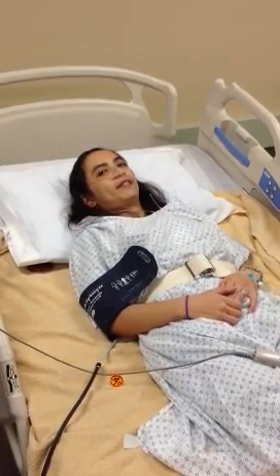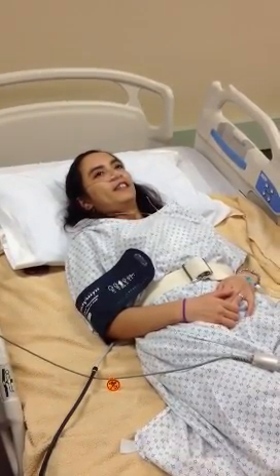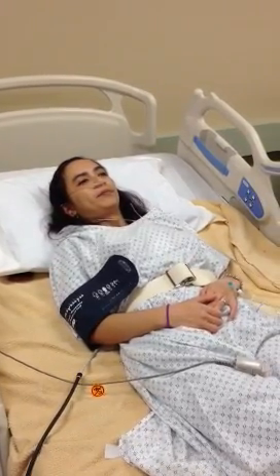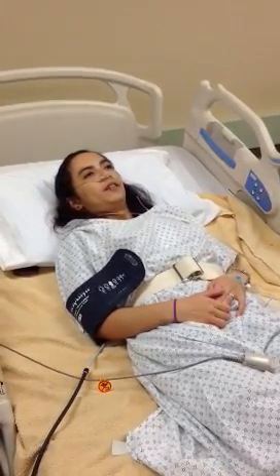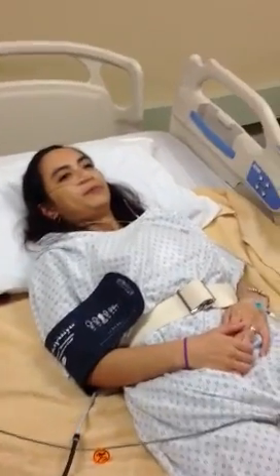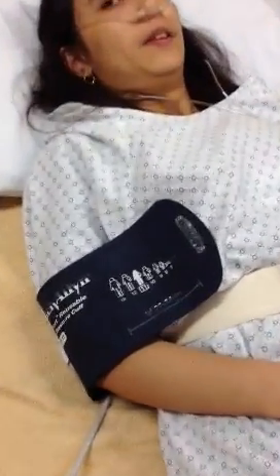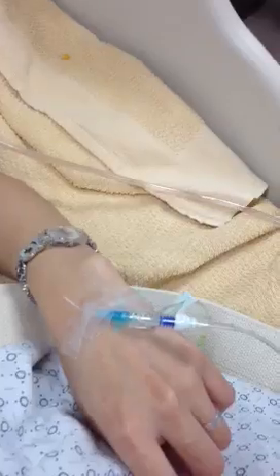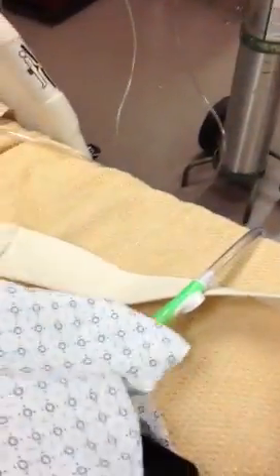This is an instructional video on how to ambulate a patient with tethers. We define tethers as any line connected to the patient that can hinder movement and increase the risk of falls or injuries. Some examples of tethers would be any line connected to a monitor, oxygen, an IV, or a catheter.